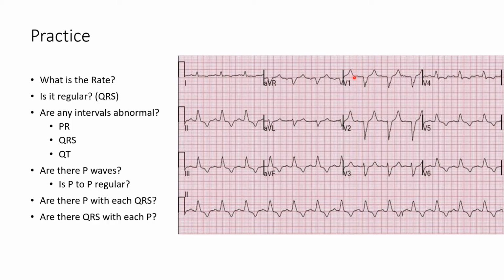However, when we look in the right and left leads, it's long in all of them. So it's unlikely this is any form of bundle branch block. I don't think it's an ectopic pacemaker, since the P waves seem to be leading to depolarization of the ventricles. So this might be explained by sodium channel blockade, and a good review of the patient's medications or potentially ingested toxins could help us figure that out. Now, what is confusing about this ECG is the T waves appear inverted, and I know that we haven't gone over that yet, but this is something that could represent ischemia or potentially hypertrophy.